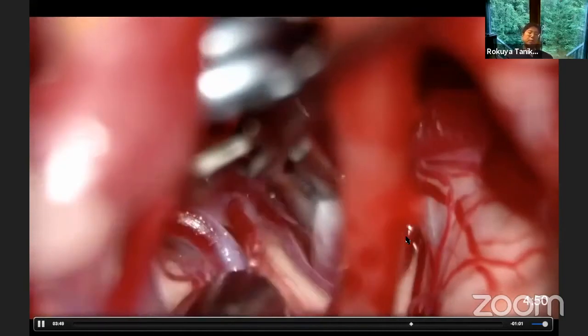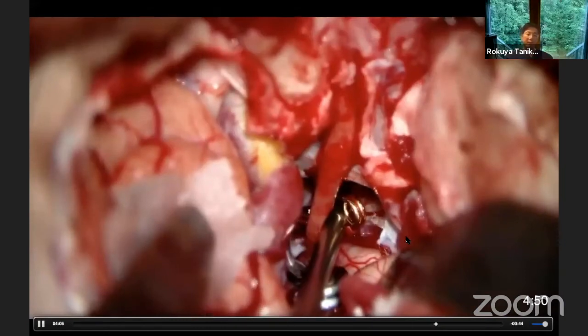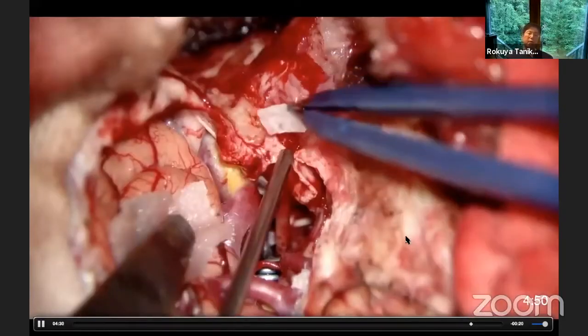This is very important — to see with the highest magnification, we need a sufficient bloodless operative field. The trans-cavernous approach for such a situation was very effective to achieve a satisfactory result. ICG angiography shows good preservation of all important vessels: ipsilateral P1, tiny perforators behind the aneurysm, basilar trunk, superior cerebellar artery — everything could be preserved.